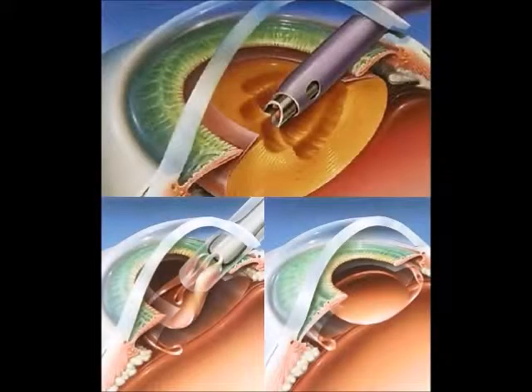The leading treatment for cataracts is a procedure known as phacoemulsification surgery, a lens removal procedure that replaces the lens with an artificial lens. First, an incision is made in the cornea. Fluids are injected into the incision to support the surrounding structure. Then the top of the lens capsule is removed to gain access to the cataract.